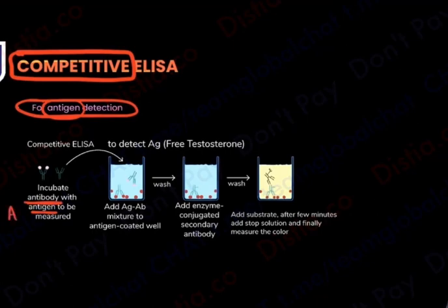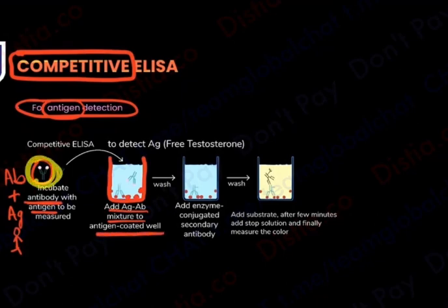You have taken the antigen from the patient and you have already added an antibody to it. So you have already done an antigen-antibody reaction outside the well. Alag se test tube mein kar diya. Pehle se course khatam. Now just imagine if you add this antigen-antibody mixture to an ELISA plate. And I know every ELISA plate I will be coating with antigens. I have already coated it with antigen, but you'll say, ma'am, when that person has already finished his syllabus outside the class, why will he come and learn anything new? Even if you put him in the class, he's going to chill. He will show everyone that, I don't study. Why? Because he has already finished his syllabus outside.